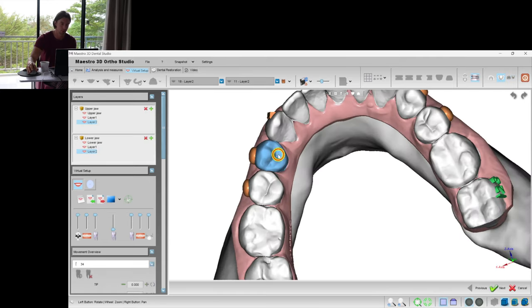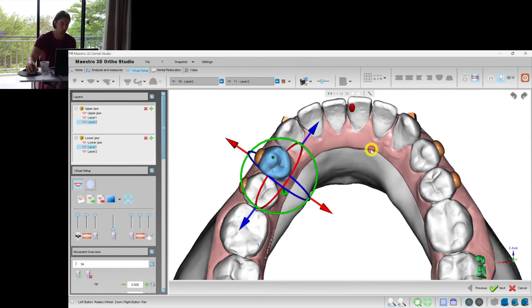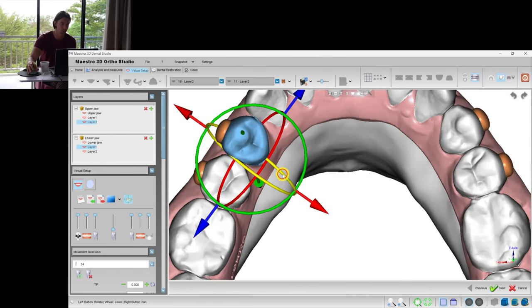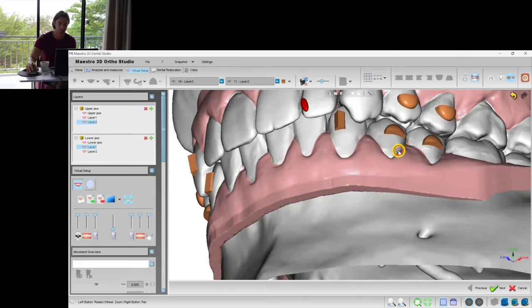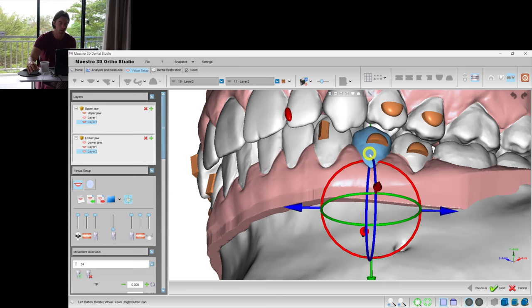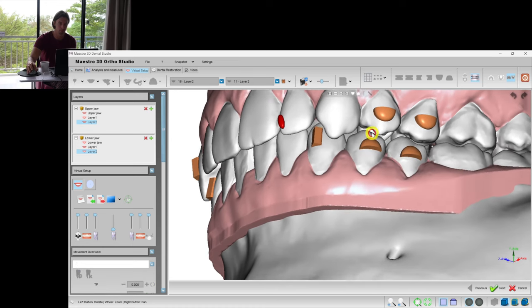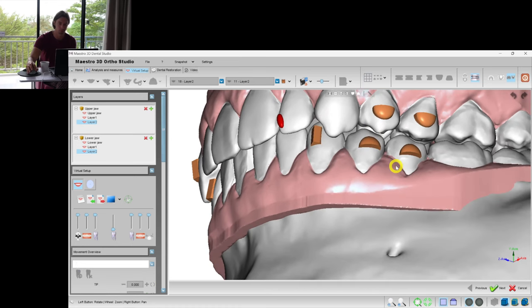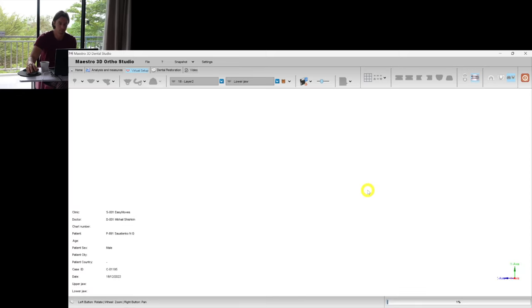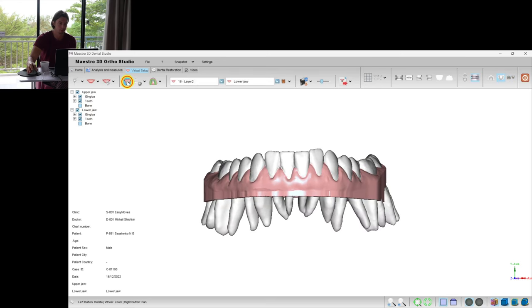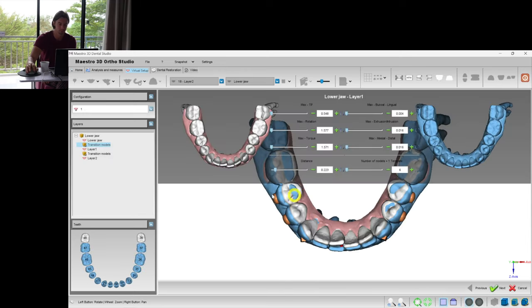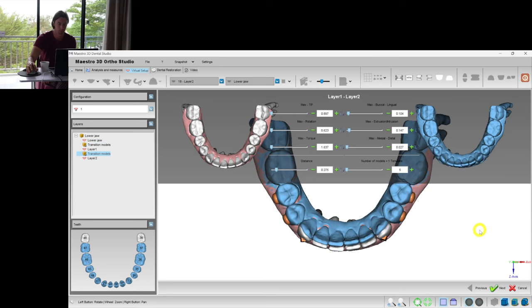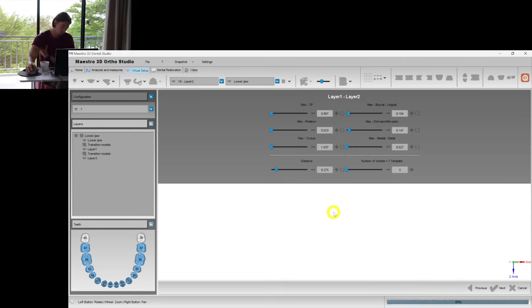And add some more tipping to layer 1. Don't need much. I think it looks better now. And here we should reset the tooth position from layer 2 to make it look like layer 1. And the software asks us to recalculate the quantity of models. So we keep the same numbers.